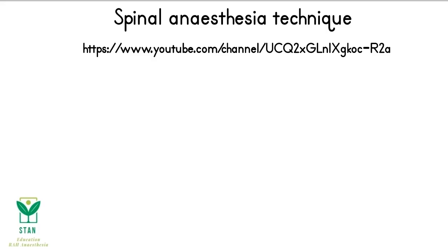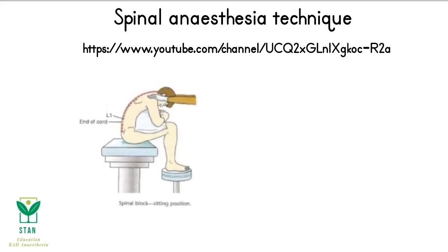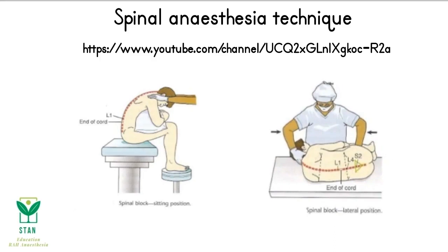Position, position, position. It is so important. Ideally have your patient sitting, as it's much easier to identify the midline and your needle is much less likely to go off course. Either sitting or lateral position, you've got to get the lumbar spine arched so the spinous processes separate and you can get access to the intervertebral space. The patient has to relax and drop the shoulders and then lean forward over a pillow, just arching their lumbar spine.